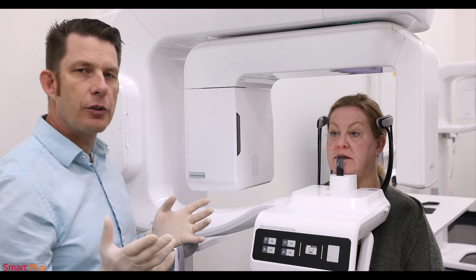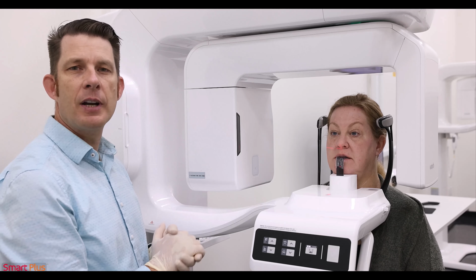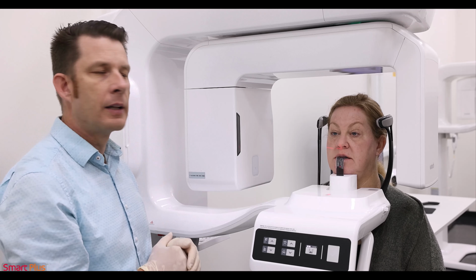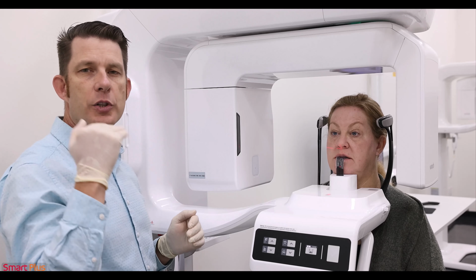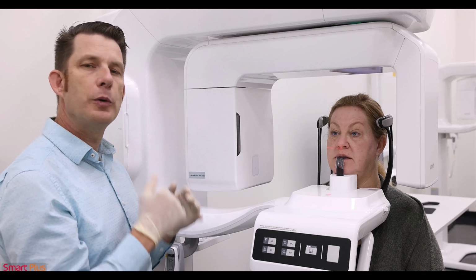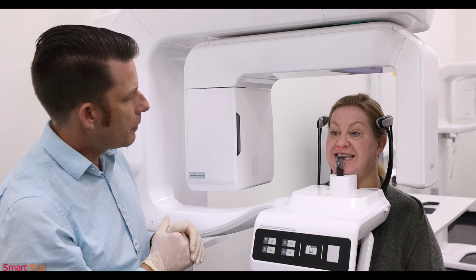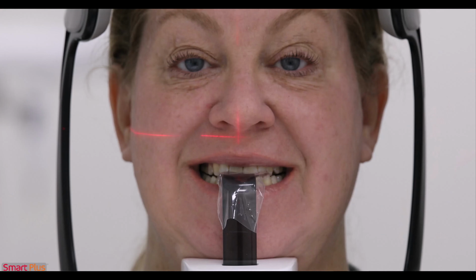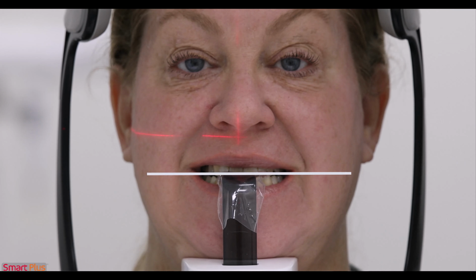Other thing to ensure with CBCT capture is that the patient's occlusion is flat or parallel with the floor. I use the maxillary occlusion as a reference. We want to make sure that the maxilla or the maxillary occlusion is flat. So smile really big for me, and I'm looking at the occlusal surface there. And if the patient's tipped up too high or tipped down, I can always raise or lower the machine. In this case, the patient has a very flat occlusion.